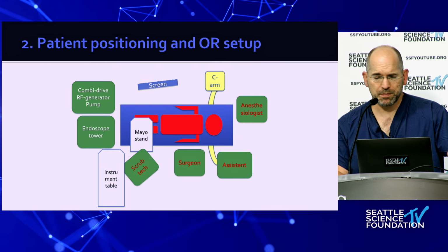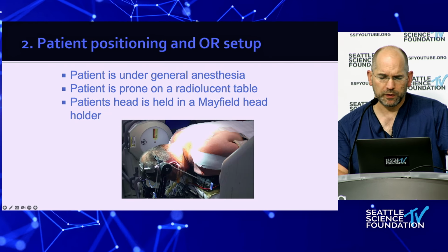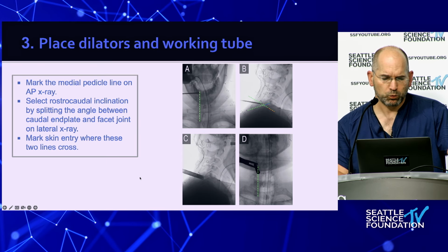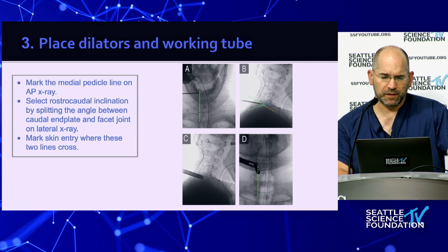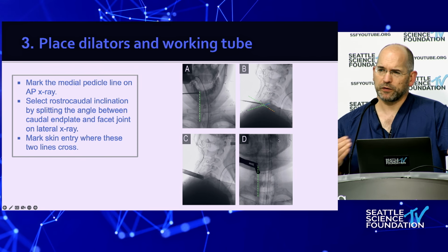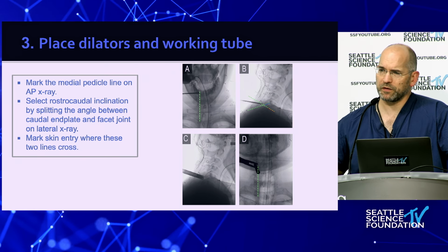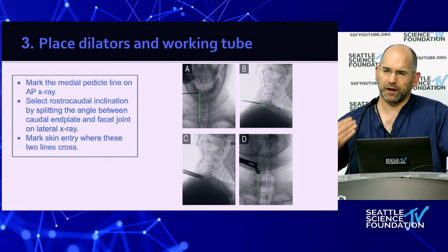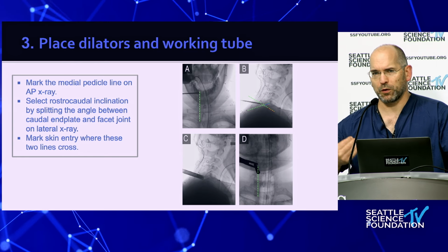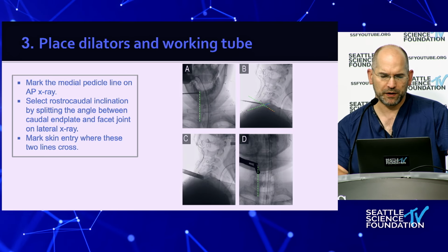Setup is the same as MIS. I do them prone here. I use a head holder, but there are a lot of people that use a horseshoe or something like that. I like to line things up, and I think everybody gets their own little system here. The most important thing is also what Patrick has shown, what I'm showing you right now. When you do these ultra minimally invasive surgeries, you have to be consistent. It doesn't matter how you do it, but you want to go in there every time the same way so you can recognize your anatomy and you know exactly how you get there.